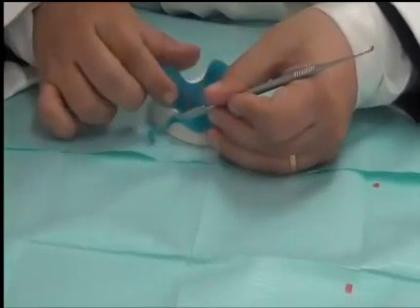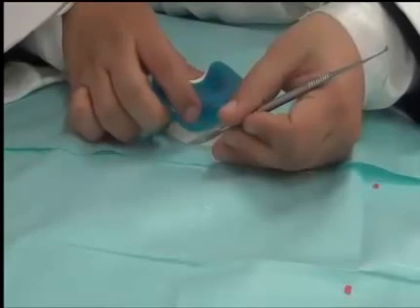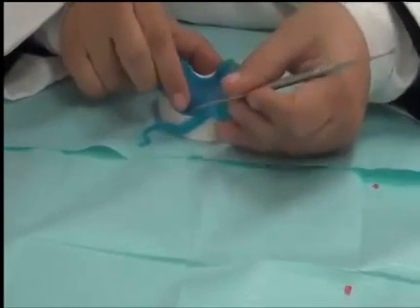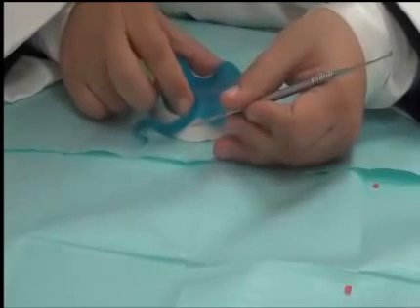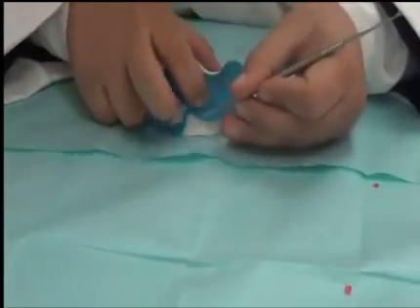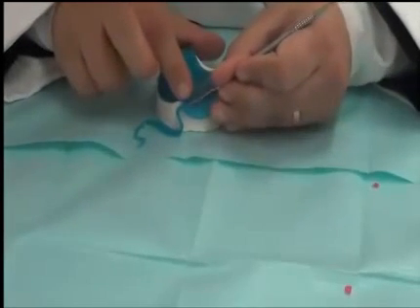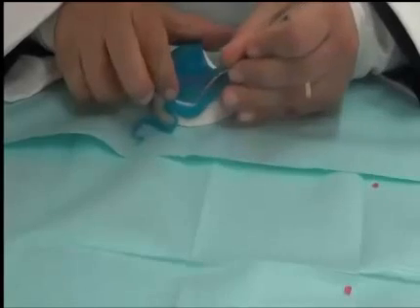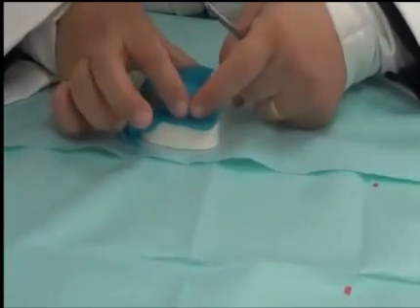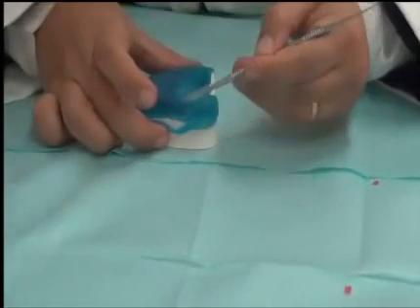I have adapted it as much as possible. The material is going over the sulcus. This is the exposed sulcus I have adapted it to. But over the land area, I just remove the excess. So fully adapted as much as possible, and then remove the excess. And this excess comes a bit longer, so we can fold it into the sulcus once more. So adapt as much as possible, and then over the land area, just remove the excess.